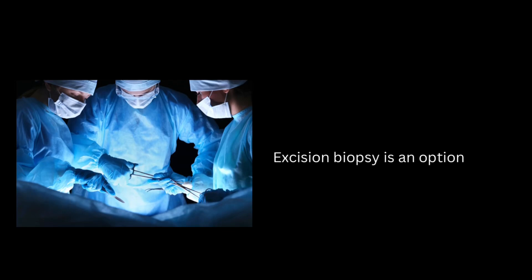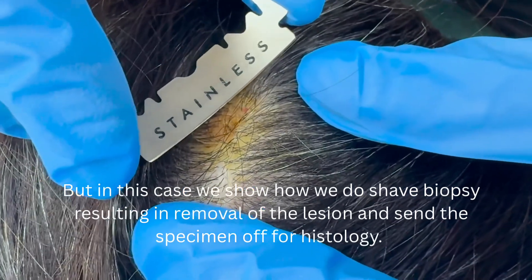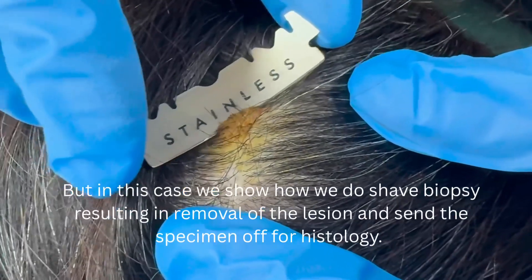Excision biopsy is an option, but in this case we show how we do shave biopsy, resulting in removal of the lesion, and send the specimen off for histology.